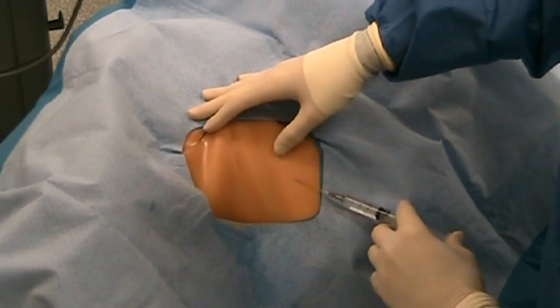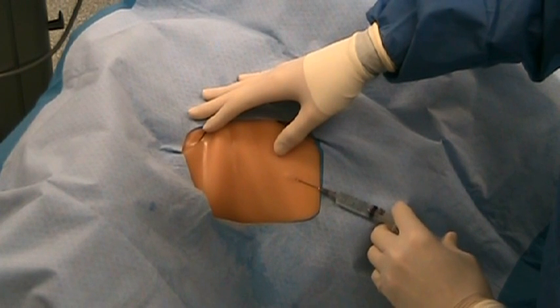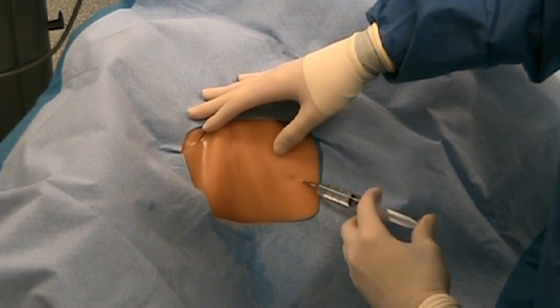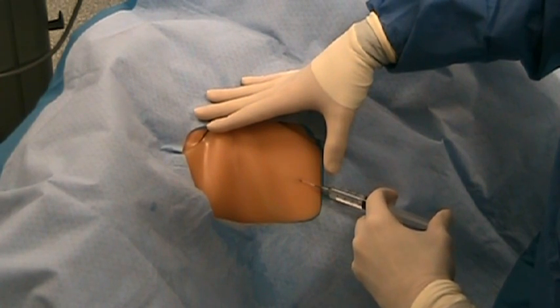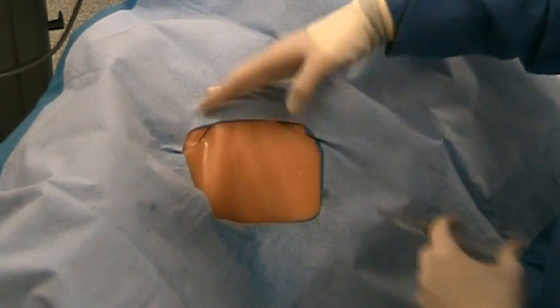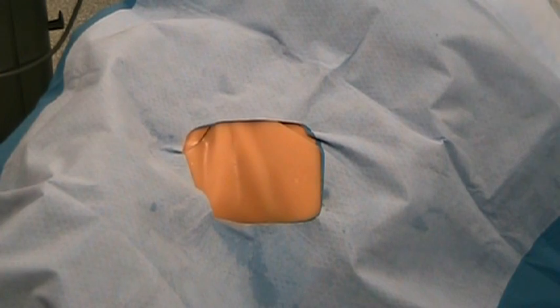The site of skin insertion is determined. Lidocaine is injected into the skin, under the clavicle, toward the subclavian vein. The patient is placed in Trendelenburg position.